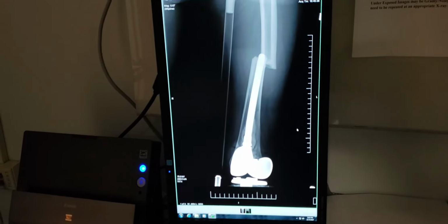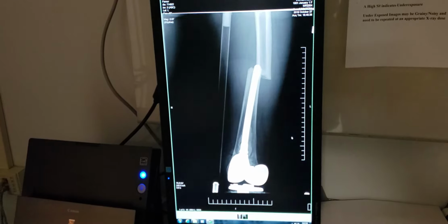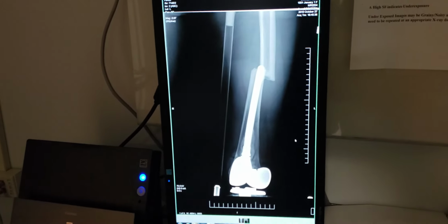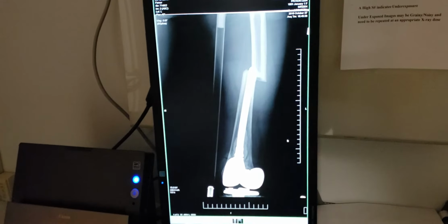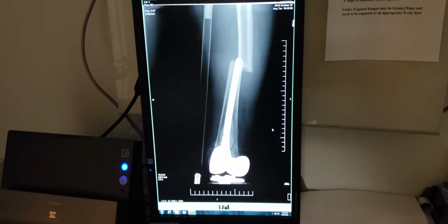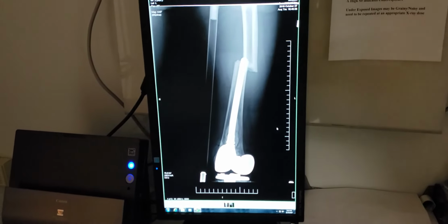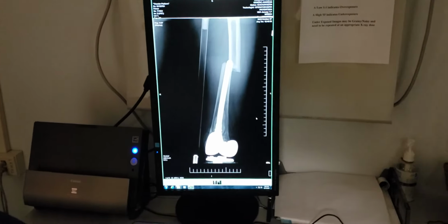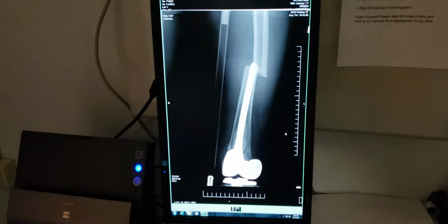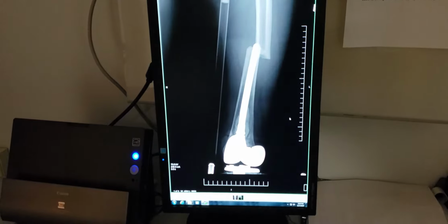So for this view, the tech didn't really necessarily need to touch or move the patient at all, which they also avoided doing as much as they could. And for this, I would give the image an A because all anatomy needed is demonstrated. The tech used critical thinking to obtain the best possible diagnostic images under the circumstances.